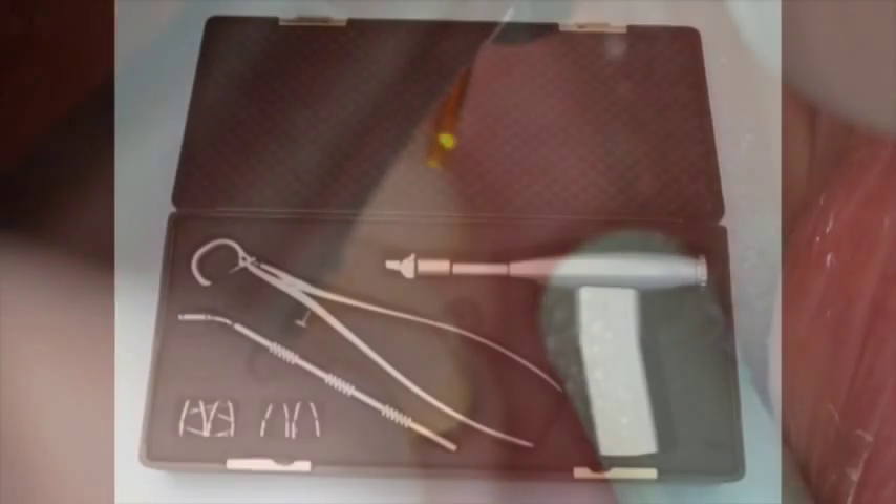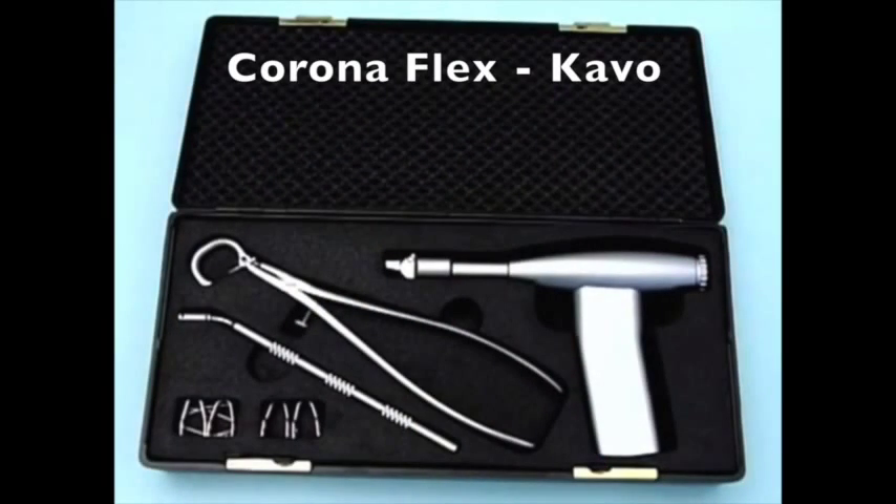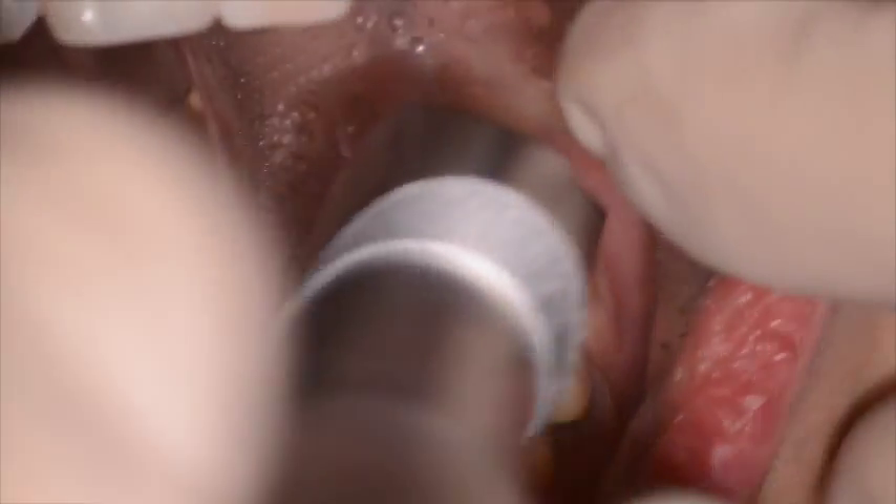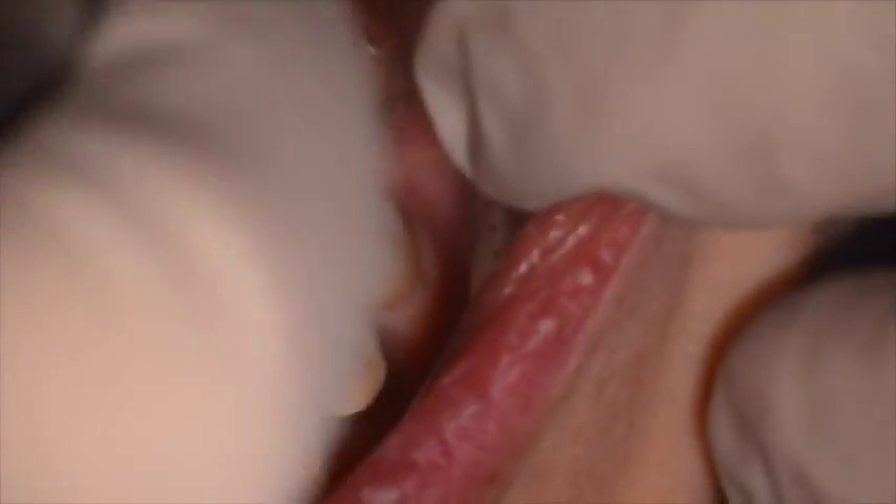After roughly 45 seconds, the laser is stopped and the cable CoronaFlex is brought over. This instrument has a small tip that when placed onto the fractured surface is literally able to crop off the remaining bonded crown.